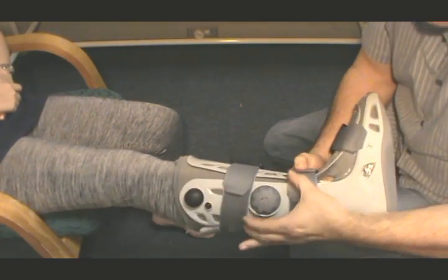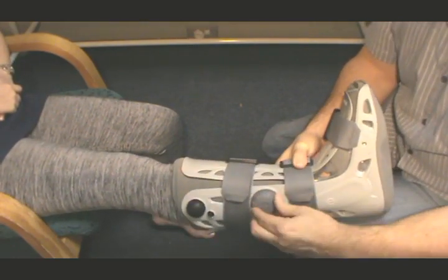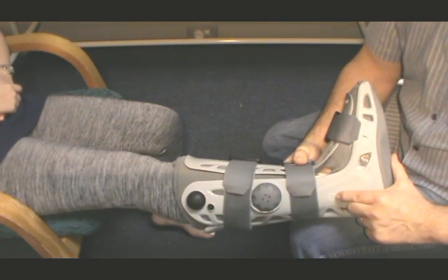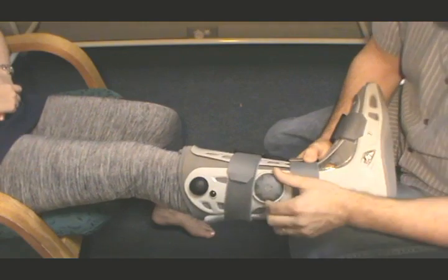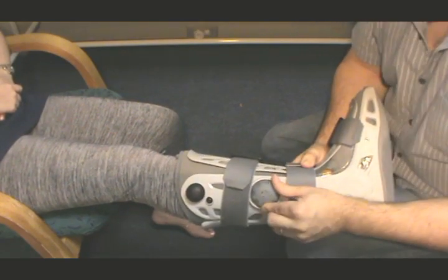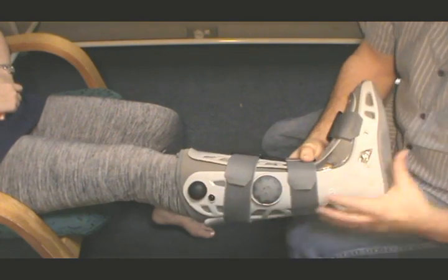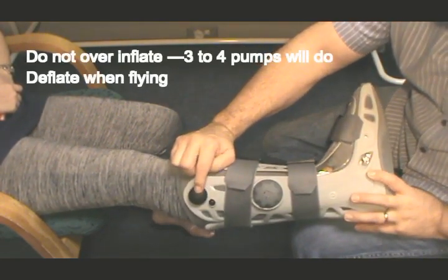So the first thing you want to do is check which dial. The dial goes 1 and 2. And that is 1. And on the other side, it's 2. So the first thing you want to do is go to dial 1. Okay, you'll see it on top there. It says dial 1. And then you're going to, this is the little pump here, but the little pump has got a hole in it.